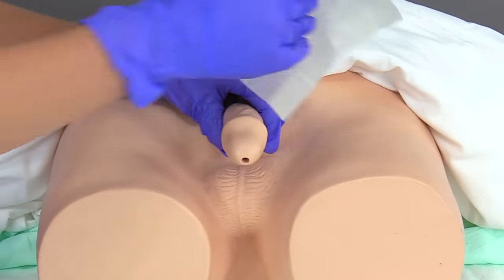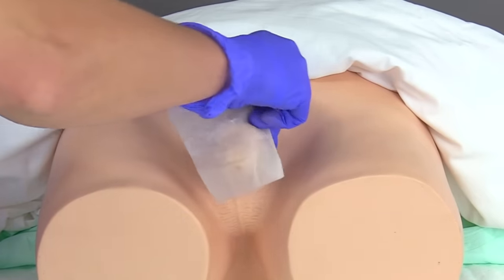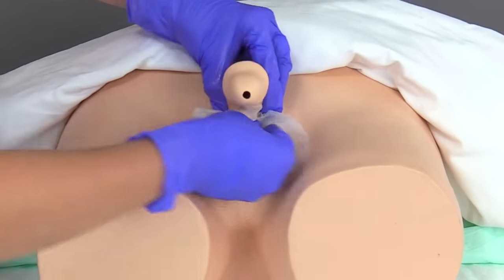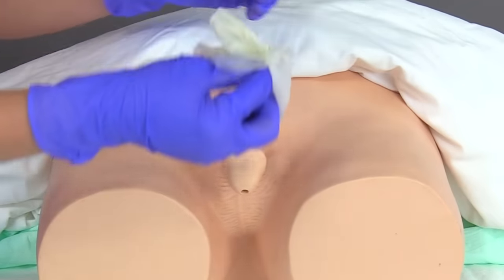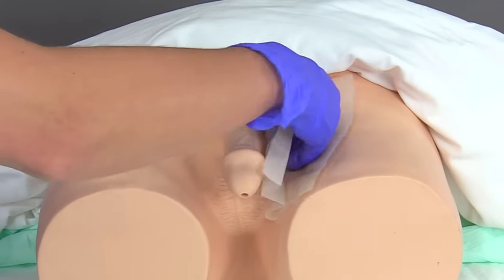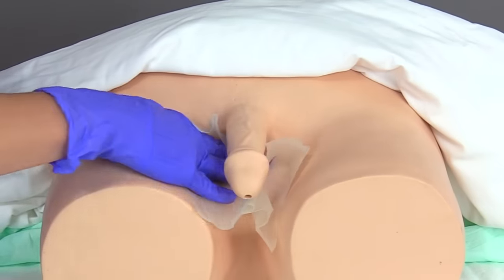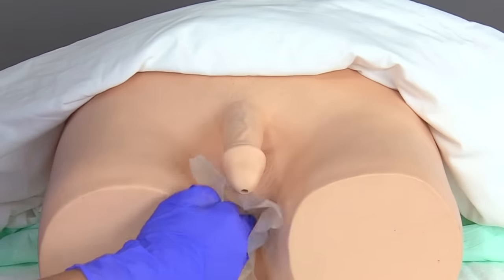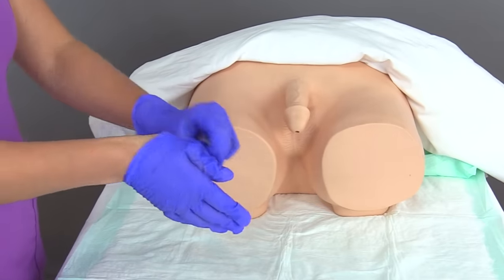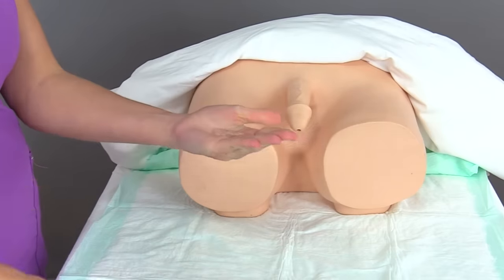With the second wipe, I'm going to clean starting at the top of the shaft, going downward in a circular motion all the way down to the base, then discard. With the third wipe, I'm going to clean each side of the groin and the scrotum, extending all the way from front to back to the anus. Once completed, doff your gloves and perform hand hygiene.